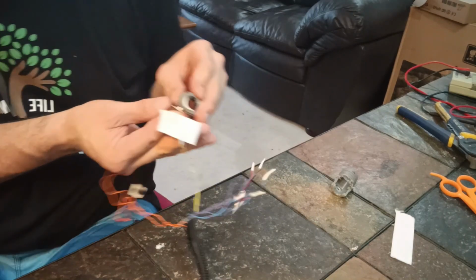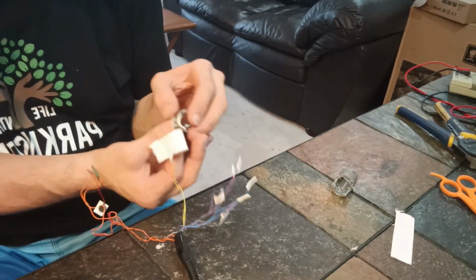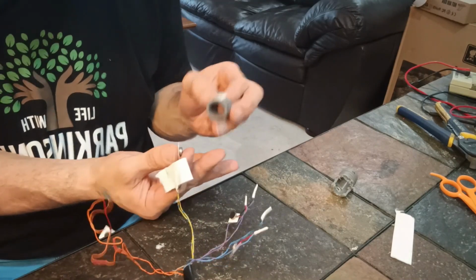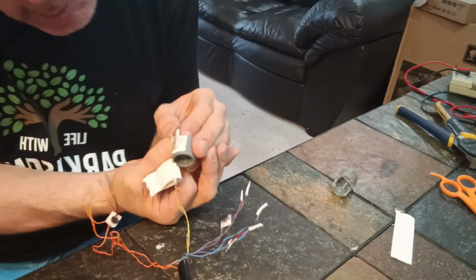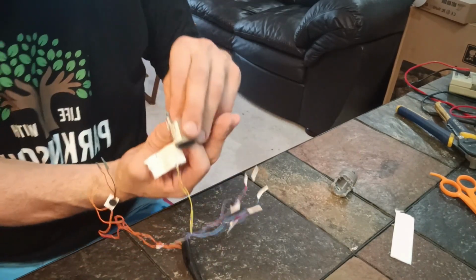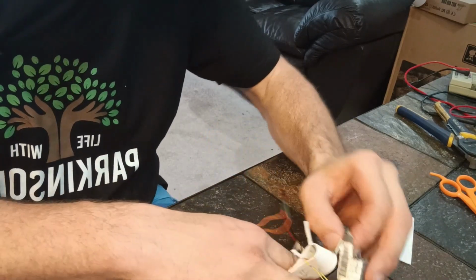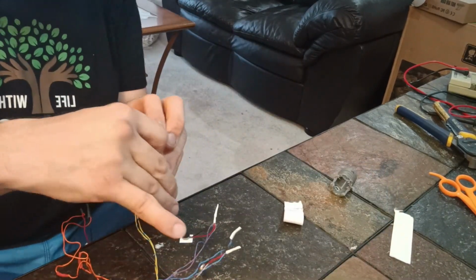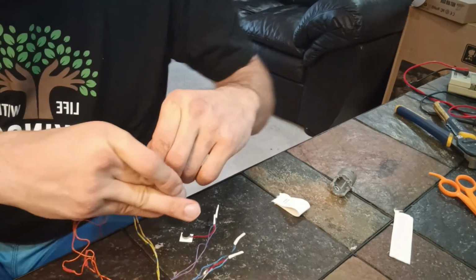Now, for a person with Parkinson's, this is where I feel like it starts to get a little tricky. I think I realized my error.